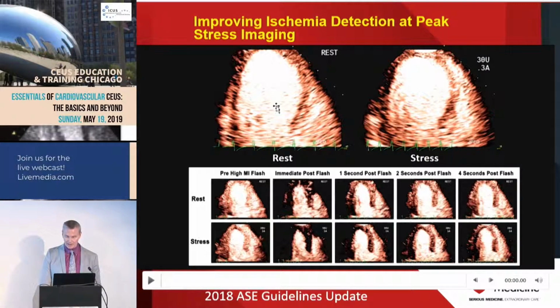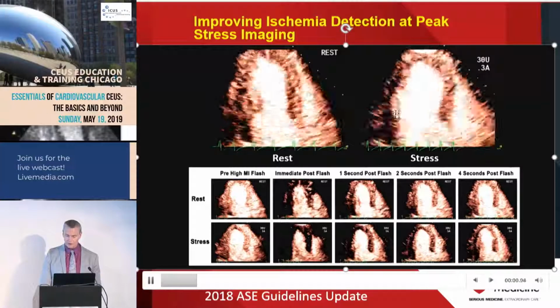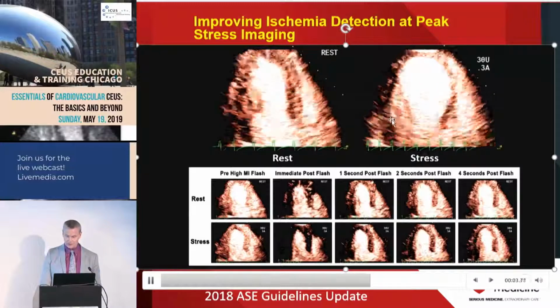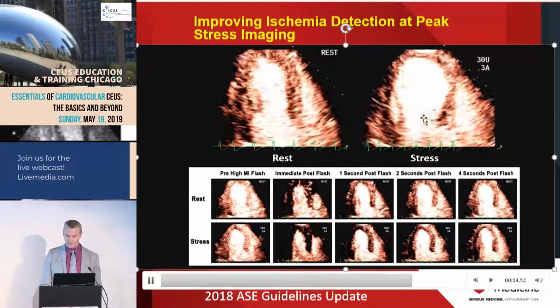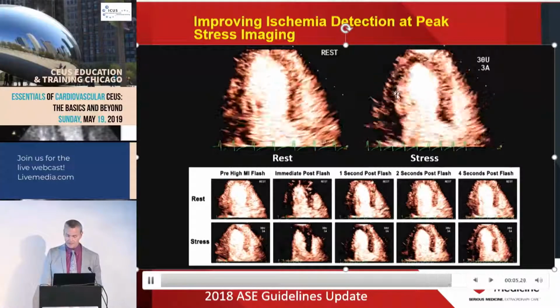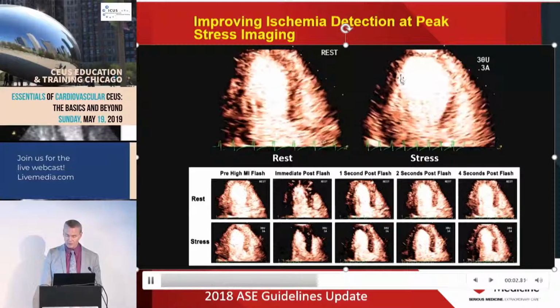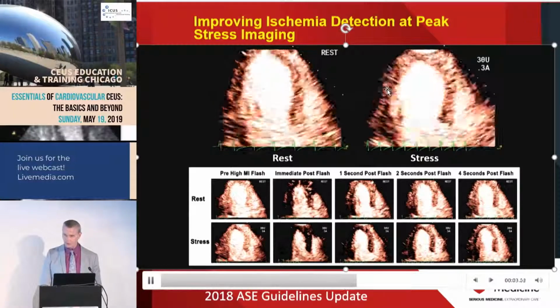This is a patient that has, here's the end-systolic rest perfusion, end-systolic stress perfusion. I show these end-systolic images just to show the wall thickening here. Also, wall thickening, we thought, during the 30 mic infusion was still pretty good, but look at this, there's no real replenishment going on here. Well, we thought there was during rest. And here we are at really 30 mics, 0.3 of atropine. No real replenishment. This is about 2 or 3 seconds after that high mechanical index impulse. This was an 80% circumflex stenosis, okay?